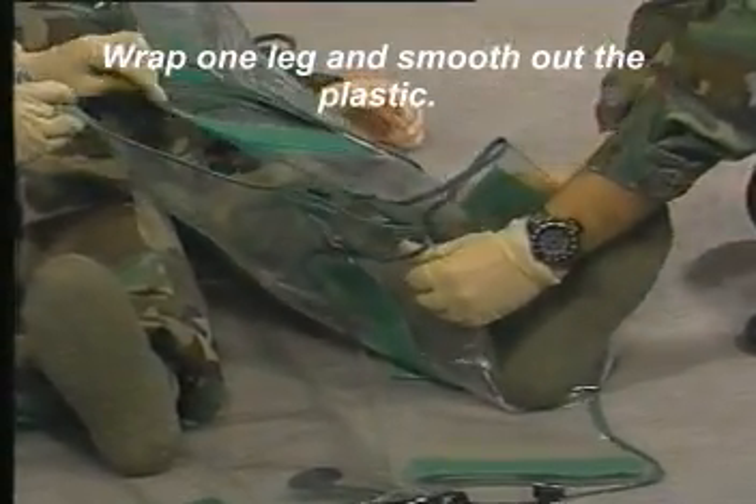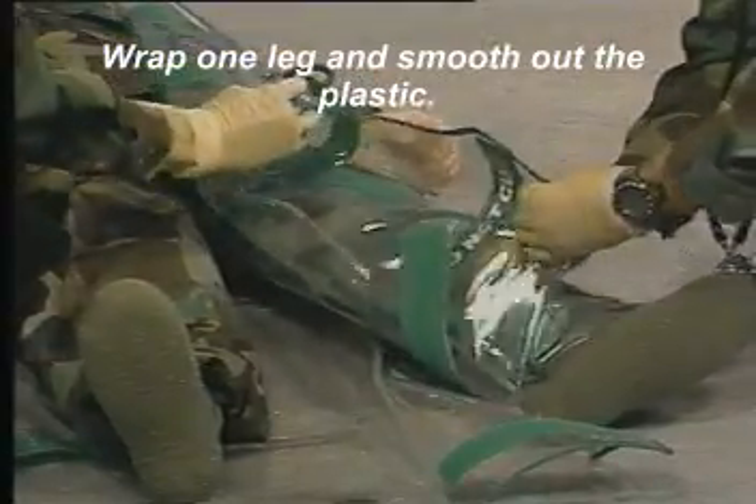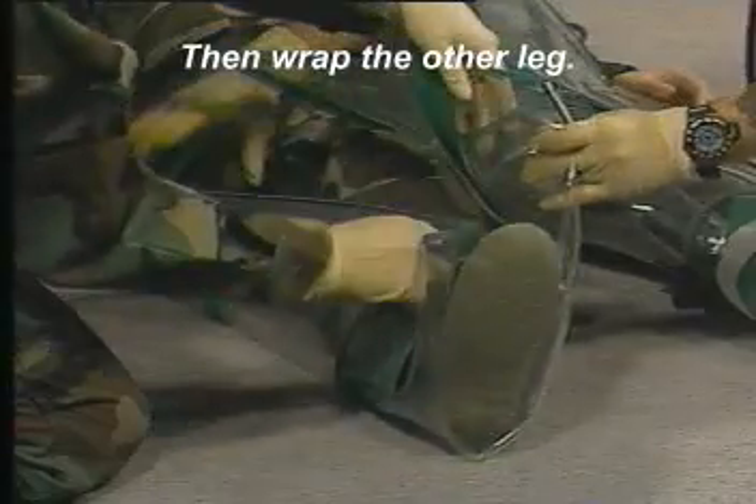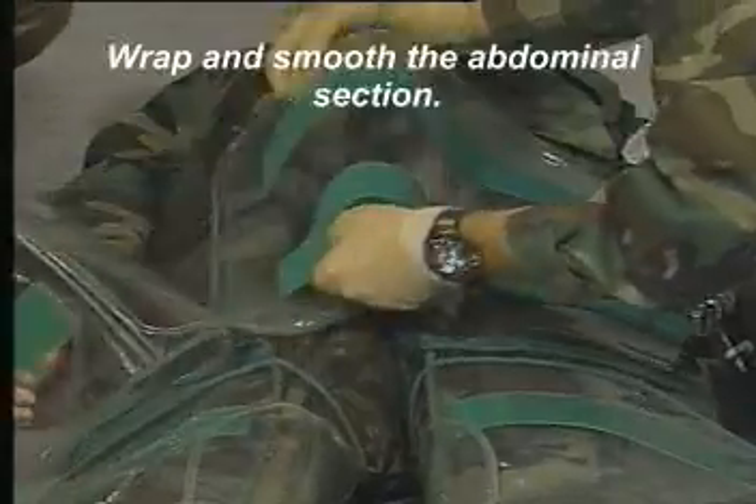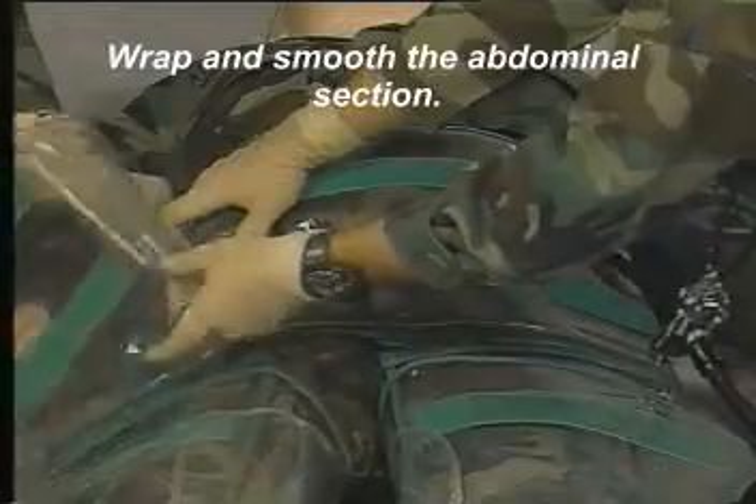Wrap one leg and smooth out the plastic, then wrap the other leg. Wrap and smooth the abdominal section.